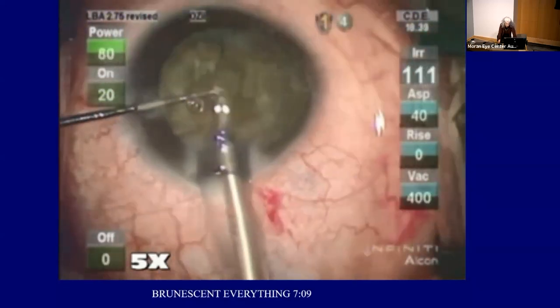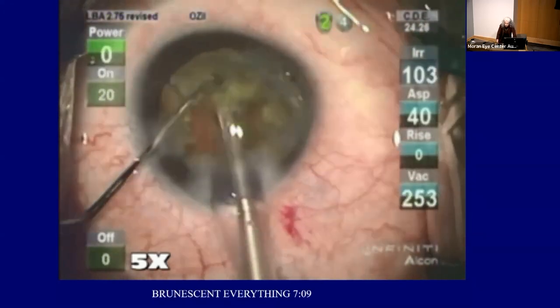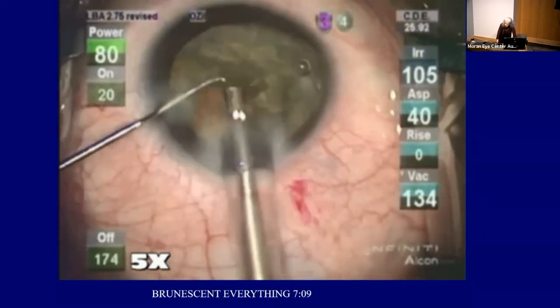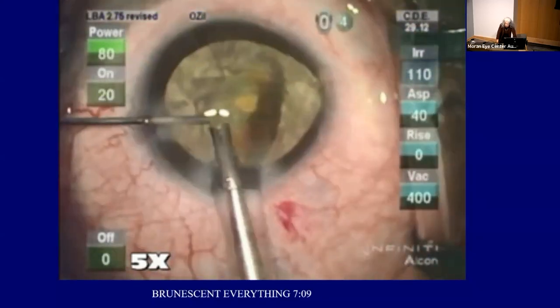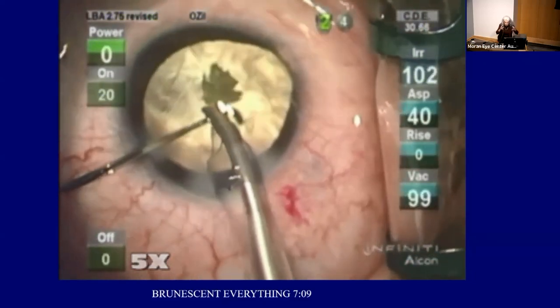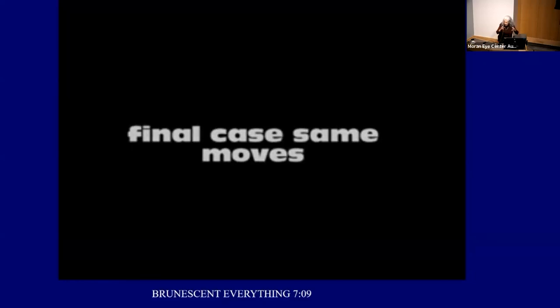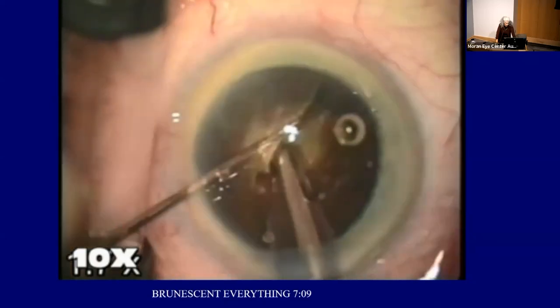As I made the point, I really don't like aspiration to be that way, aspiration flow. But you make a good point, and there's nothing wrong with linear vacuum. Aspiration, you just can't intuit what's going to happen. It either happens faster or slower, or you get this close to the piece and it works right now, but then you change your aspiration flow rate and have to get that close to the piece for it to come. So that's why I'm not a fan.